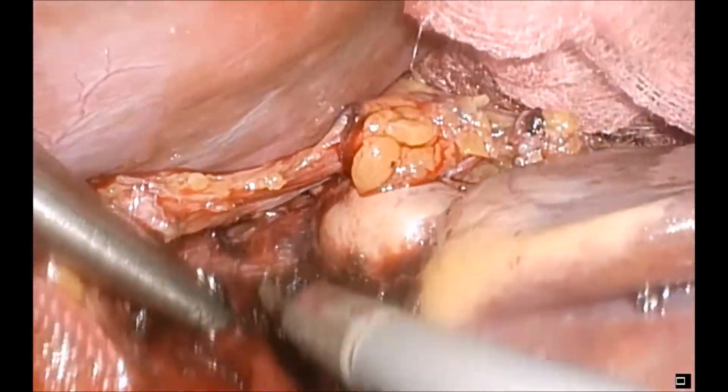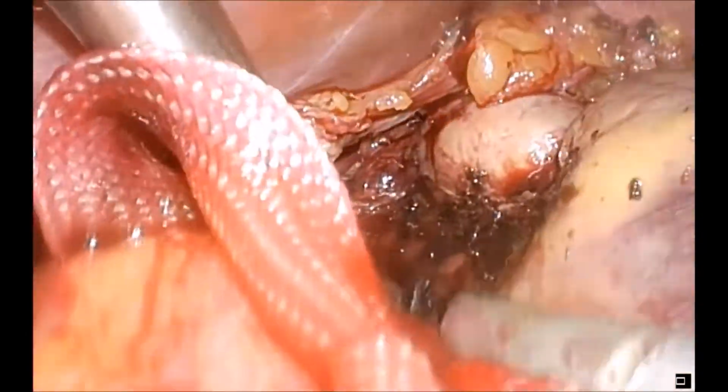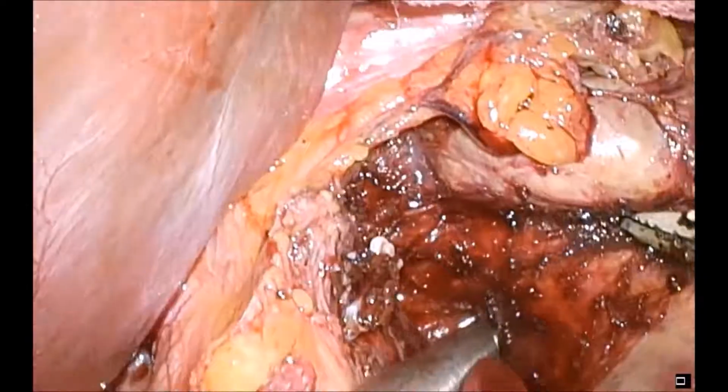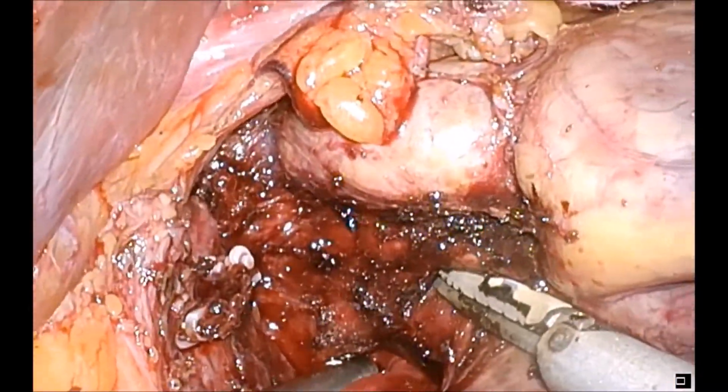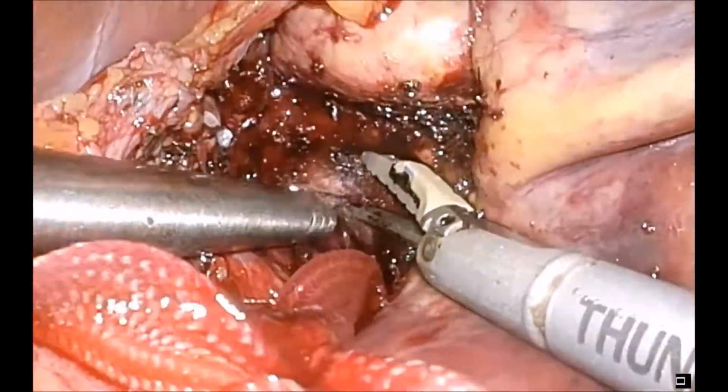The view is a bit blurry here because it's bifocal vision. It was clear the other camera was working well, and now the camera's been cleaned and we get a much nicer view.